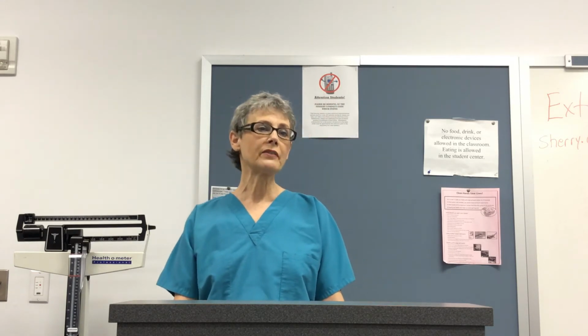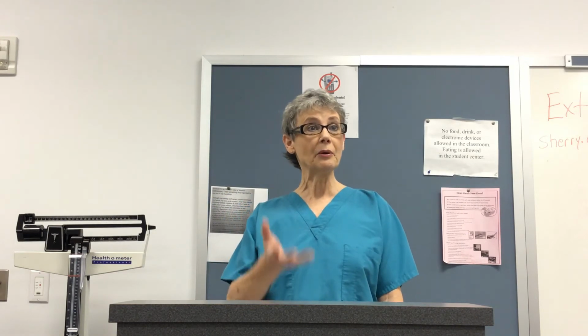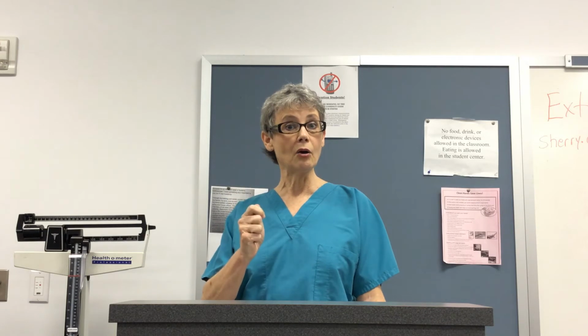To lower the risk of getting air, you want to start the IV with the patient's arm below the level of the heart. And you want to keep the IV bags up on a pole above the level of the heart. And if your patient has to go to surgery, or down to radiation or radiology, make sure that you take that fluid on a pole.